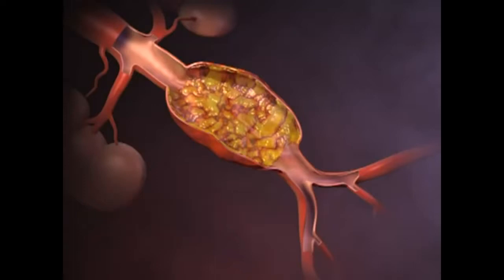In this procedure a guide wire is introduced into the abdominal aorta through a femoral artery. This is followed by the sheathed main body of the stent graft which is positioned with the use of fluoroscopy.